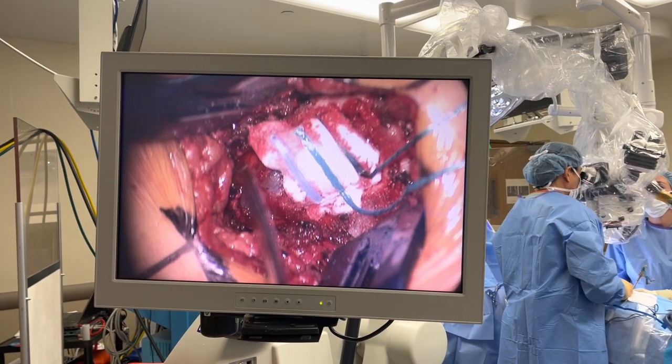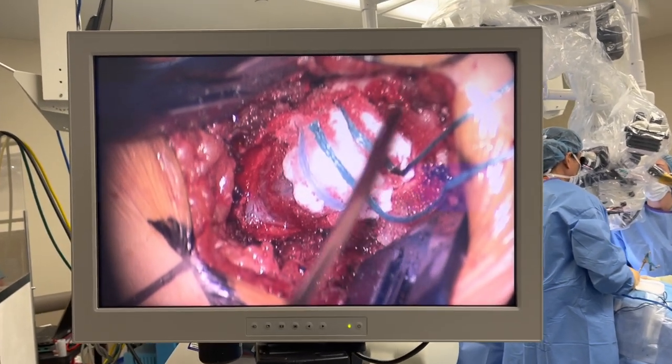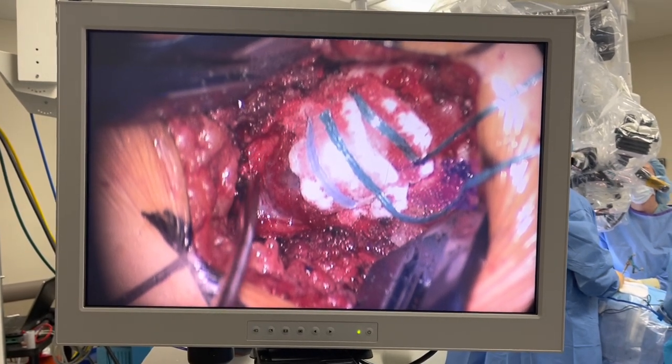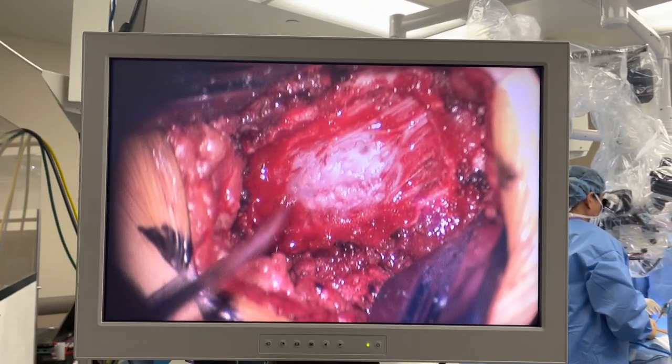Look how nasty and inflamed this looks. So that's normal right there. I'm going to put a stitch there as a holding stitch, and a stitch proximally as a holding stitch. I'm going to use them as two anchors, and then I'm going to incise it and do everything. Got the Tarlov cyst exposed.